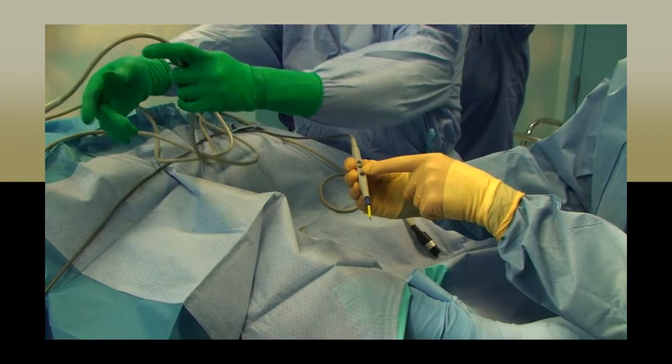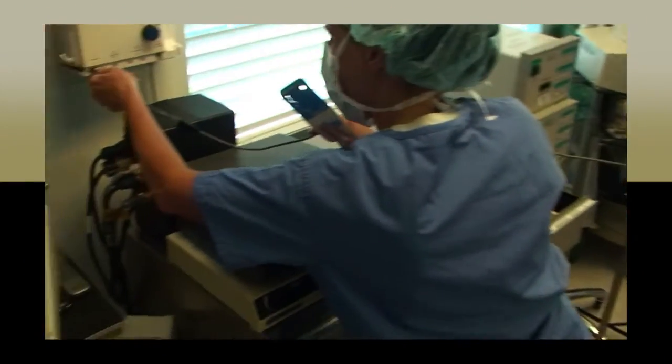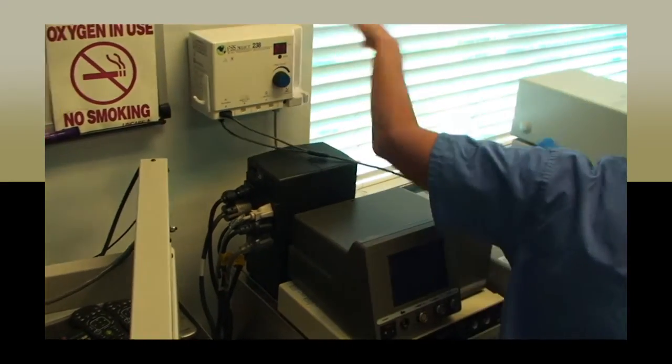During the surgical case, as the surgeon cuts into the patient's skin, they may come across certain veins that are in the way. He will utilize electrocautery to keep these from bleeding as he cuts through them. In order to set up this Bovie system, again, take the power cord, whose end contains 2 plugs, thread it through the drape guides, and hand the ends to the circulator to be plugged into the power source.